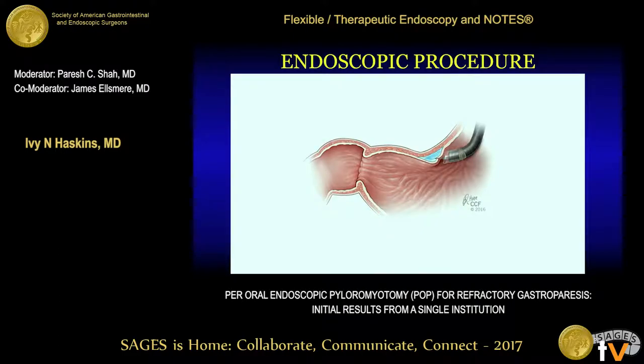At our institution, the POP procedure is performed in the operating room under general anesthesia. The first step is the development of a submucosal tunnel. In order to do this, methylene blue is injected approximately 5 centimeters proximal to the pylorus. Next, using a triangular tip knife, a transverse mucosotomy is made at the site of previous methylene blue injection. Using the TT knife and the endoscopic cap, the submucosal tunnel is then developed along the lesser curvature of the stomach through the pyloric channel and into the first portion of the duodenum.